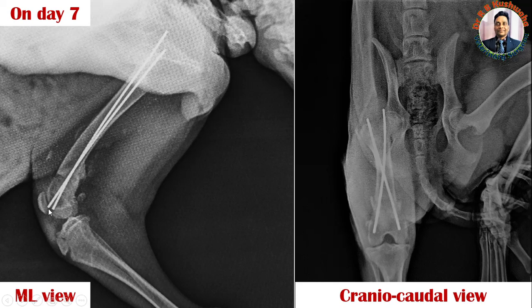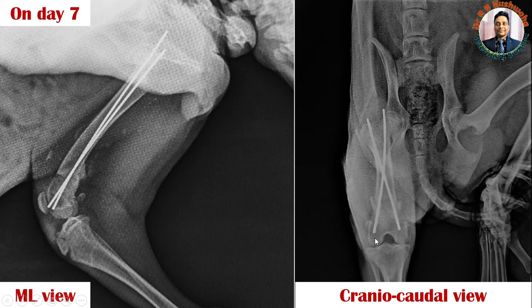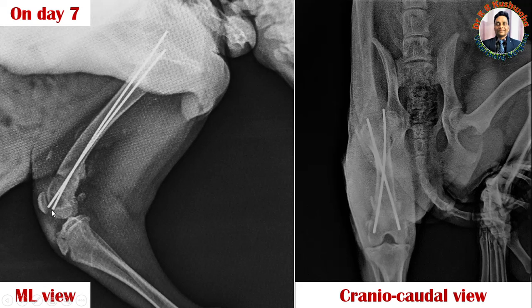From this mediolateral view it appears that the end of this K-wire is touching the patella or emerging from the articular surface, but that is not the case — the radiograph is a two-dimensional view of a three-dimensional object. If you see the same in the craniocaudal view, you can appreciate that the end of the pin is within the condyles, and even if it crosses to that level it will not affect the gliding of the patella over the trochlea, because the patella glides over the trochlea. So never be confused if the pin end appears to touch the patella or cross the articular surface.